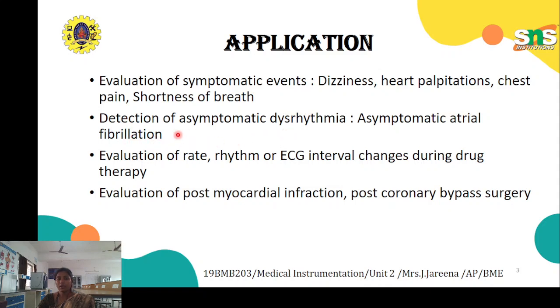So it helps to detect asymptomatic dysrhythmia. Next, we can easily evaluate our heart rate, rhythm, and ECG interval changes during drug therapy. Certain drugs may have an impact on our ECG signal, so by using the Holter monitor we can record and analyze such changes in the ECG through continuous monitoring.